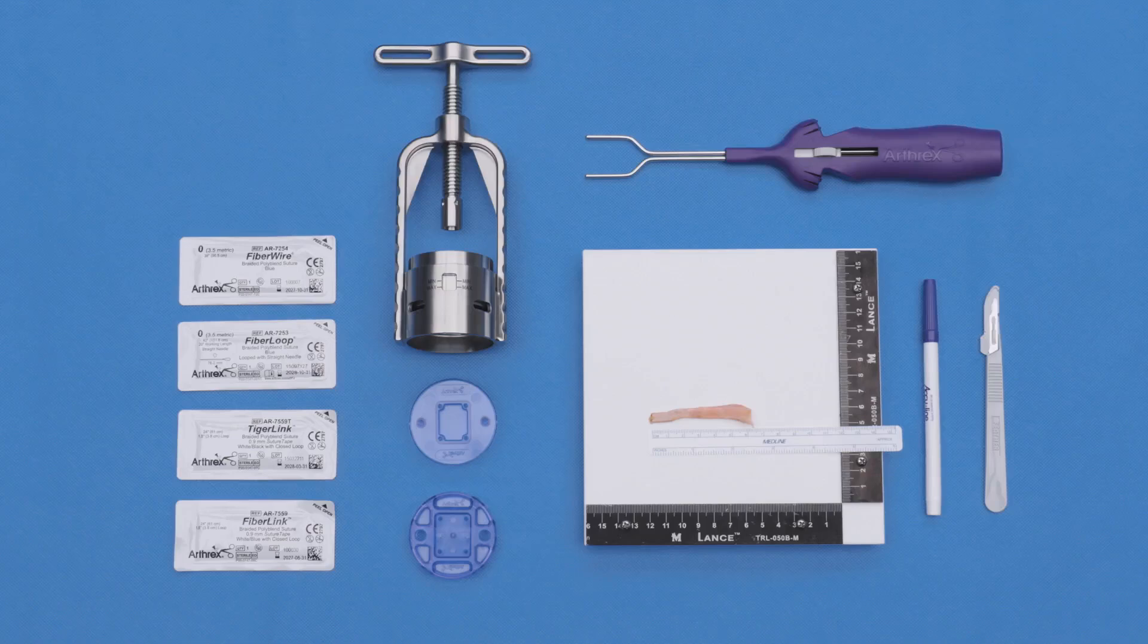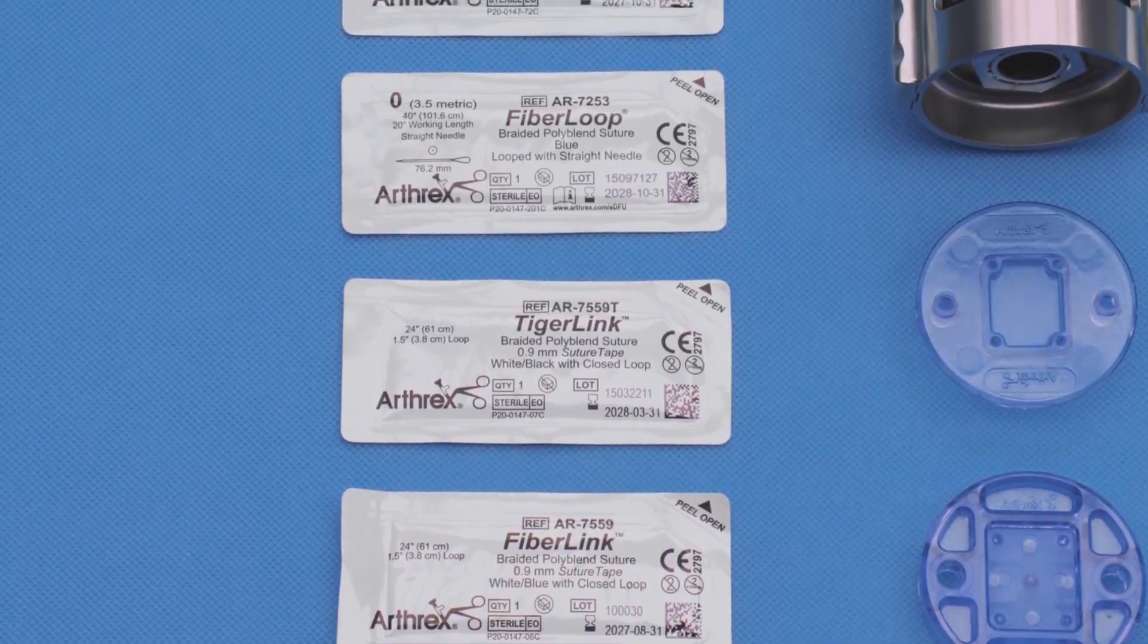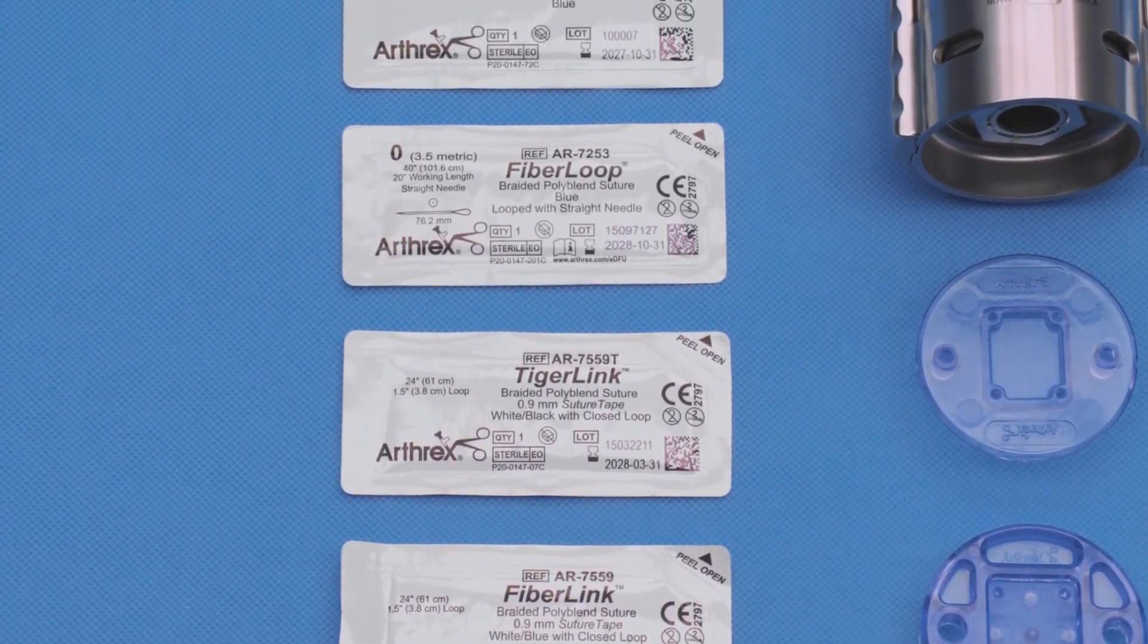We are going to demonstrate the recommended technique for graft preparation for the Autograft Tissue Compression System, or Biceps SMASH, for use in the CuffMend Rotator Cuff Augmentation Procedure.